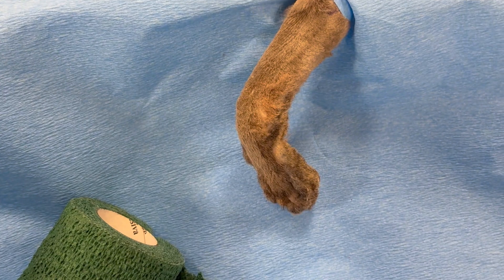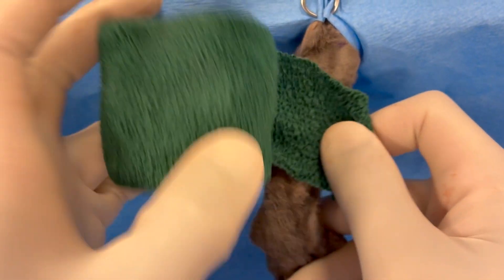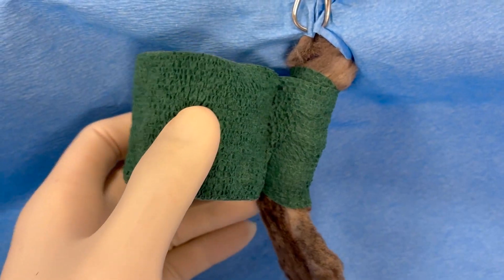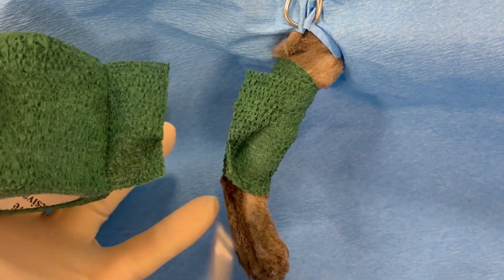For any distal extremity surgery in small animals, including a digit amputation, it can get very bloody. The distal extremity is very vascular, so it's often useful to apply a tourniquet. Here we're just using some vet wrap, but in a larger animal you might want to use a proper Esmarch tourniquet.